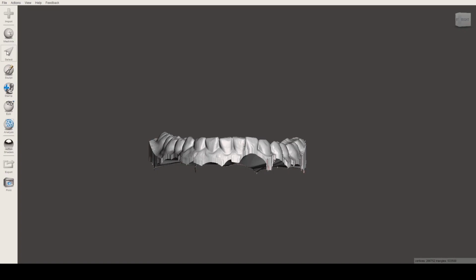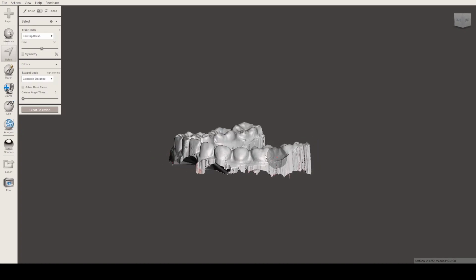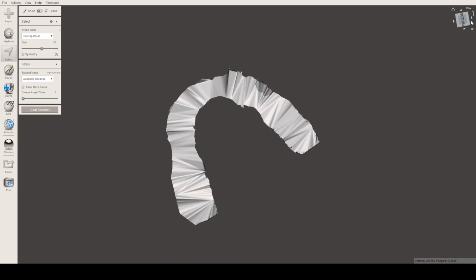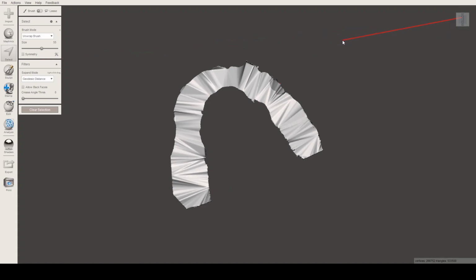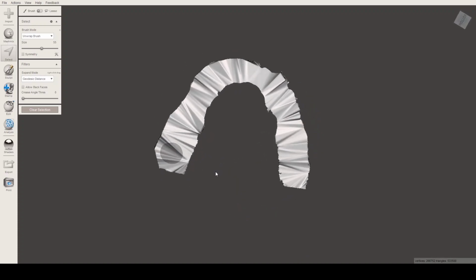Now let's stop selecting the whole thing. Let's escape first. Now, what else can we do here? Oh, we can actually, yeah, let's go to the bottom, and then we can try to extrude. Extruding will add a layer to this model. It will just add layers to it. Nothing really special.